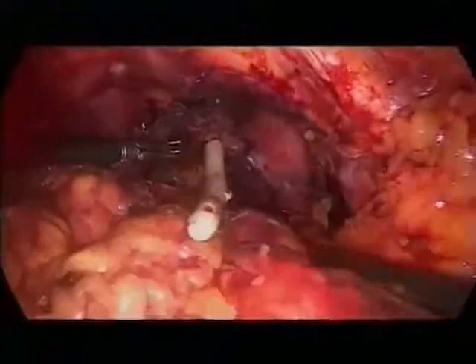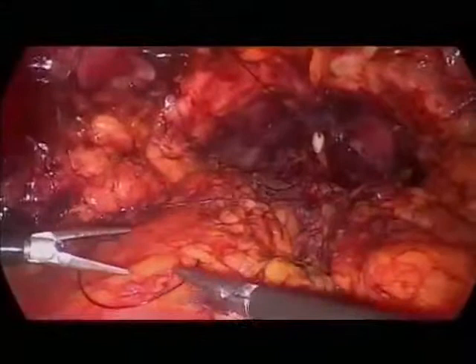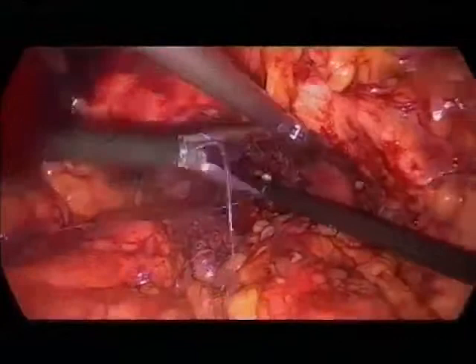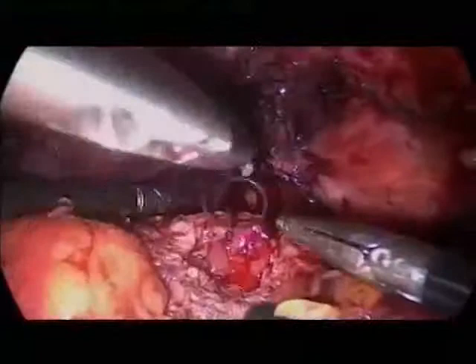I think this would be nice for you to show exactly where you have to go, to divide your vessels to try from the pedicle. I am going to try to show you. This is this other vessel that you are describing. Yeah, yeah. You see, I think we can put a clip at this point.